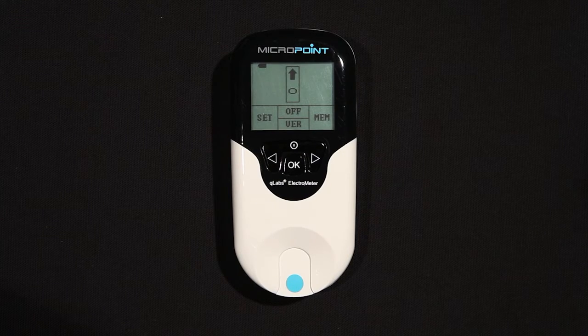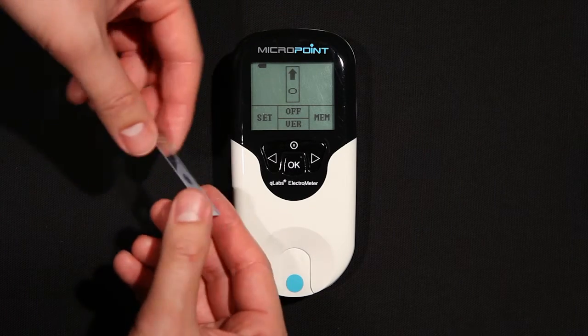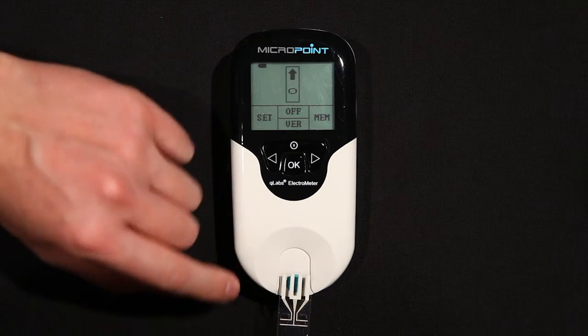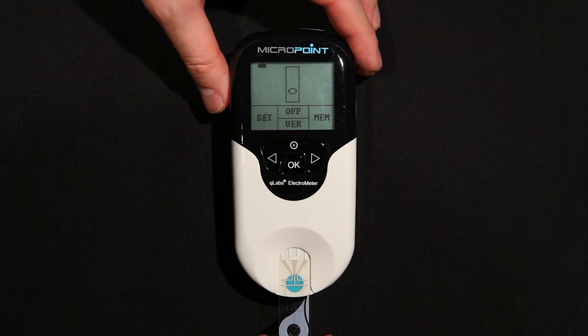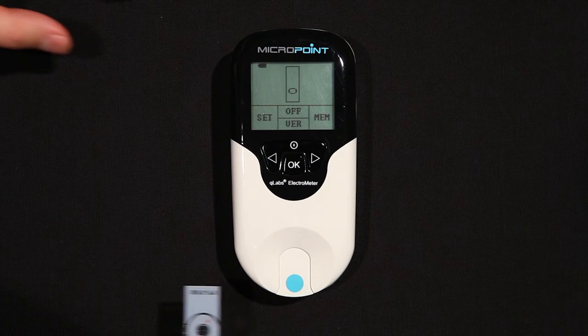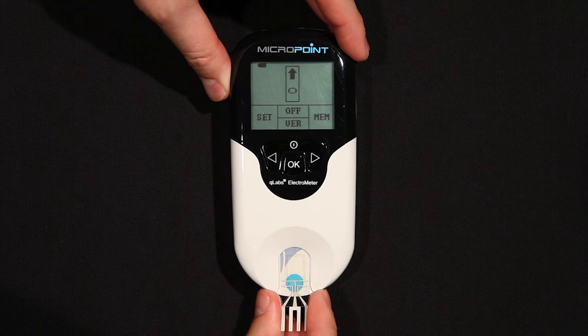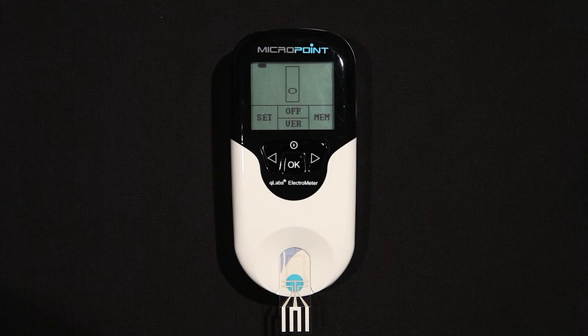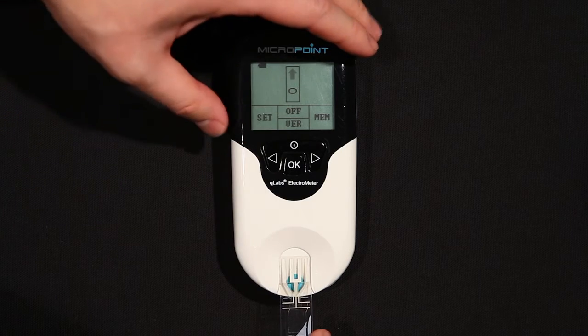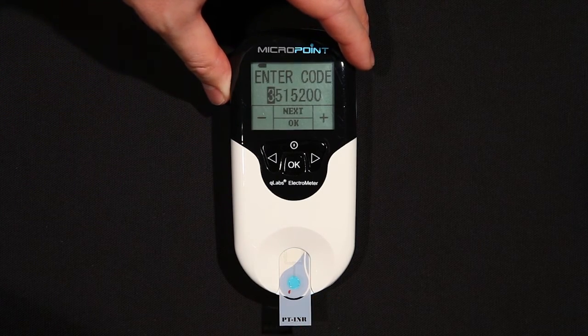When performing a test, the Q-Labs Electrometer should be operated on a level surface that is free of vibration. Testing on an uneven or unstable surface may cause inaccurate results. Insert a fresh test strip into the test strip guide with the PT-INR logo facing right side up and the electrode leads going into the Electrometer. It is very important to insert the strip the correct way. If you do not see the display prompt to enter a strip code, it is very likely that you inserted the strip upside down. Remove the strip, turn it over, and reinsert it. When the strip is inserted correctly, you should be able to read PT-INR from left to right.